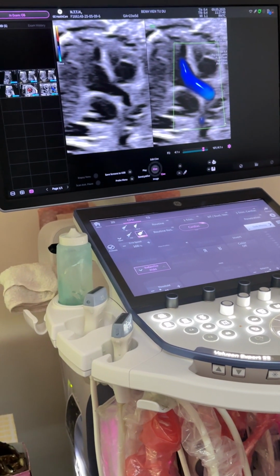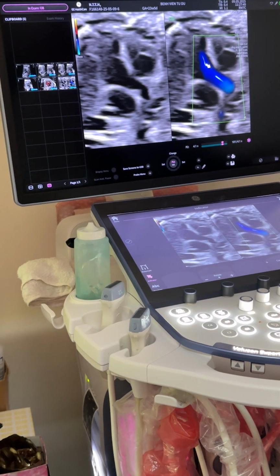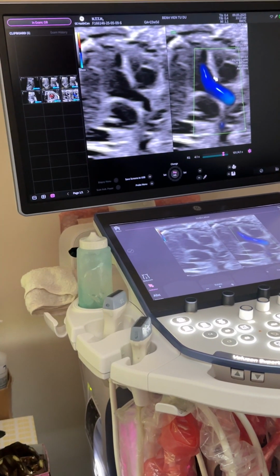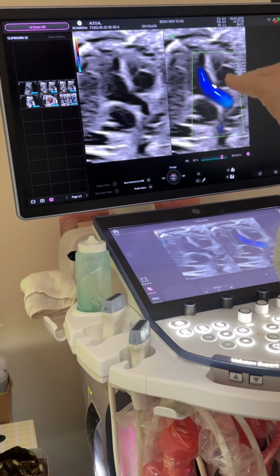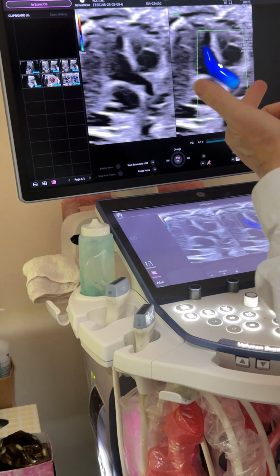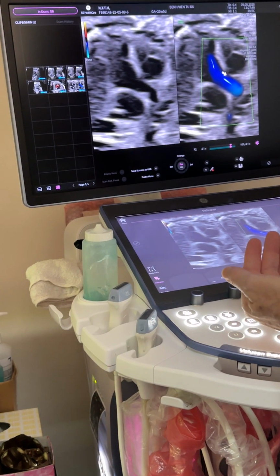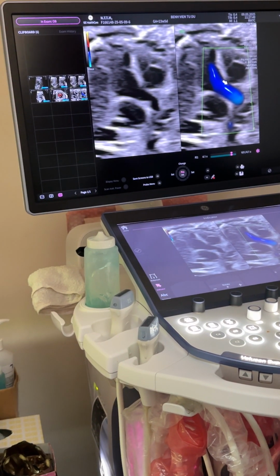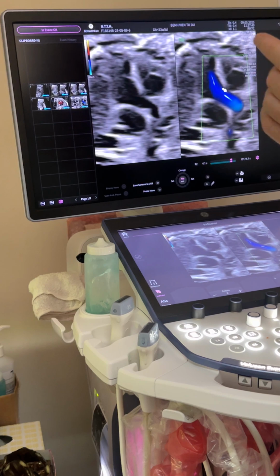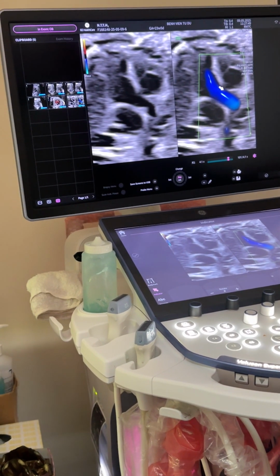This is normal. So I'm getting normal left ventricular outflow tract, and there is no wash of color in the area where I see dropout. But the dropout that I saw was not at the LVOT. The dropout that I saw was inferior at the inflow into the heart. So that's more worried about an inlet VSD. This is more the view you look for a perimembranous VSD or outlet VSD. Outlet VSD, really you look at short axis. Longitudinal axis is really perimembranous.